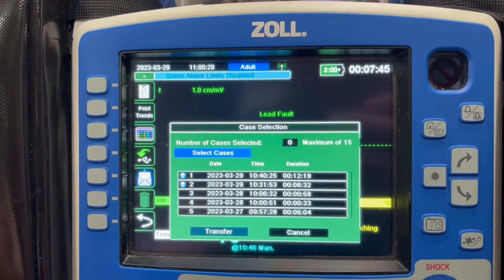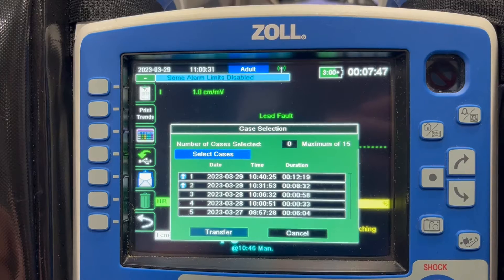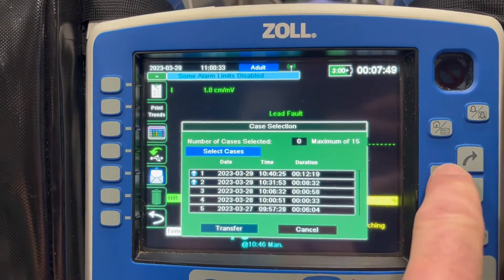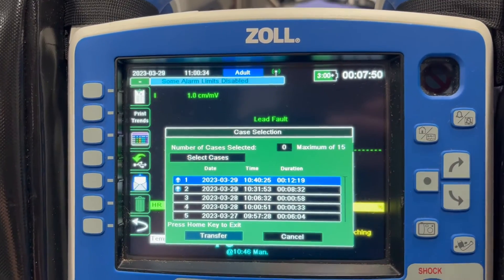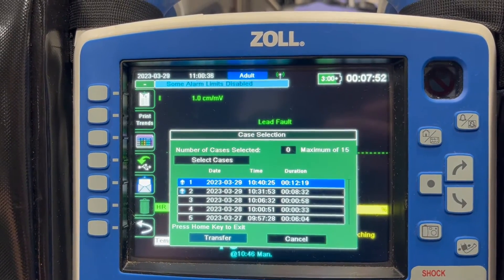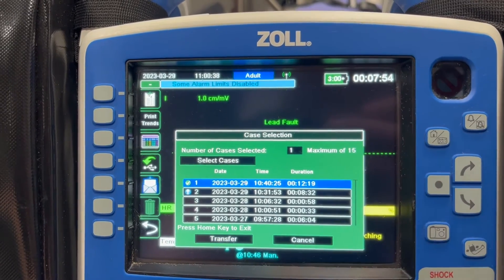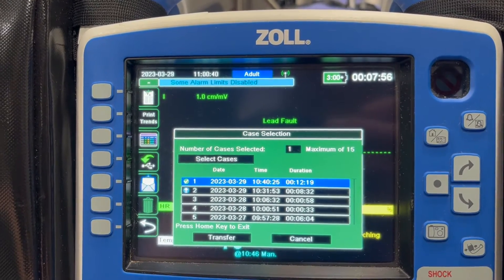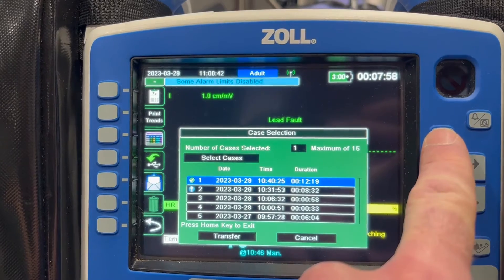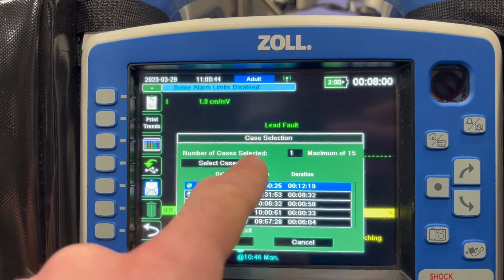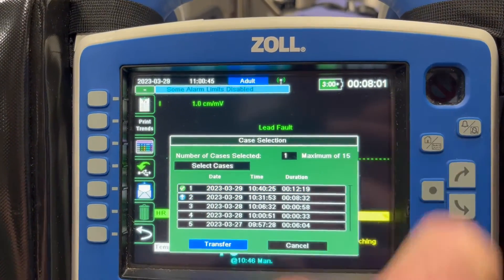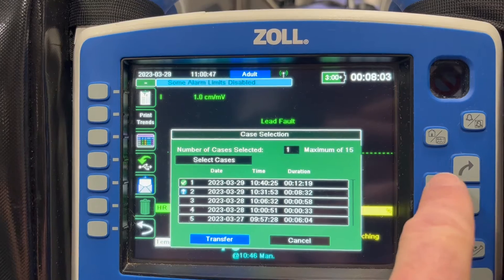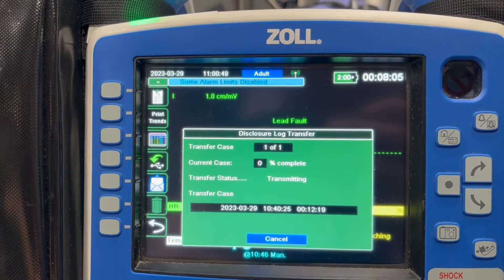But either way, it's going to pull you into this list of case files. You're going to select which case file you want. It's probably going to be the first or second more than likely. You hit enter, you'll see a green check mark come up next to it. You're going to press the home key to exit. You're exiting this selection criteria so that transfer gets highlighted and then you hit enter again to transfer it.